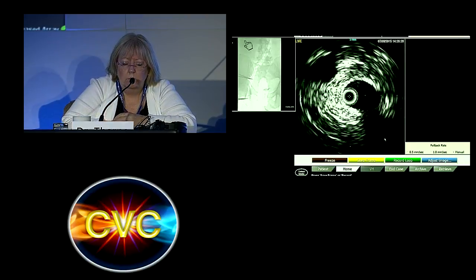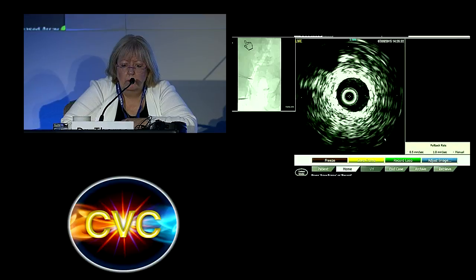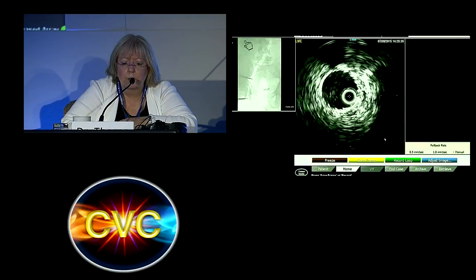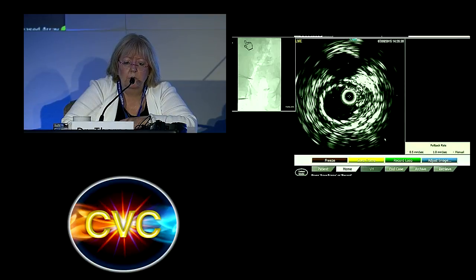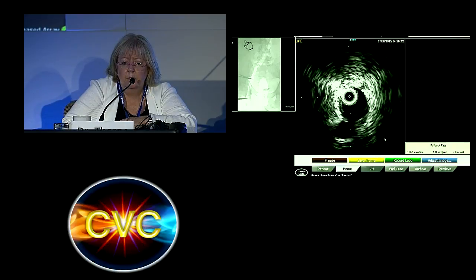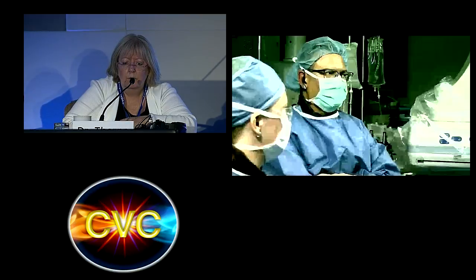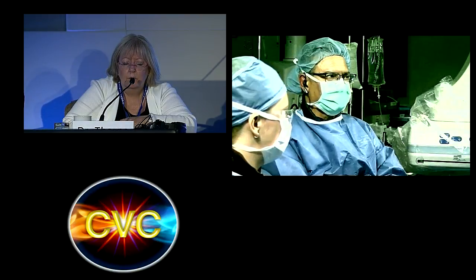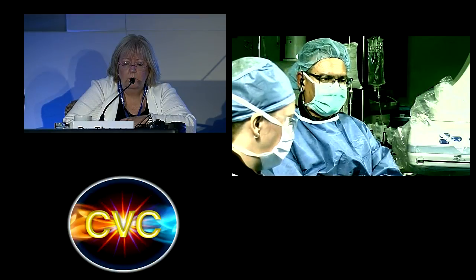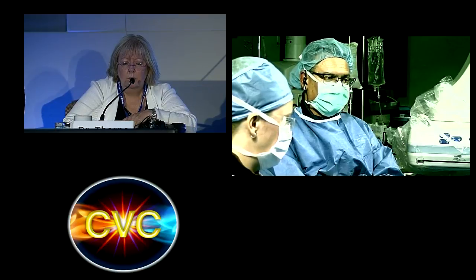I know that some of you are probably not in favor of putting a second stent here, but I think we can just wait. I think it's ambiguous. It is right where the artery is, and maybe in a different position there's more arterial compression than we're appreciating. Yeah. I think I'm going to finish right here. Maybe wrap the case. I'm going to follow him closely. I'm sure you're going to look at him as well, Patty. And I think the main problem is being treated.